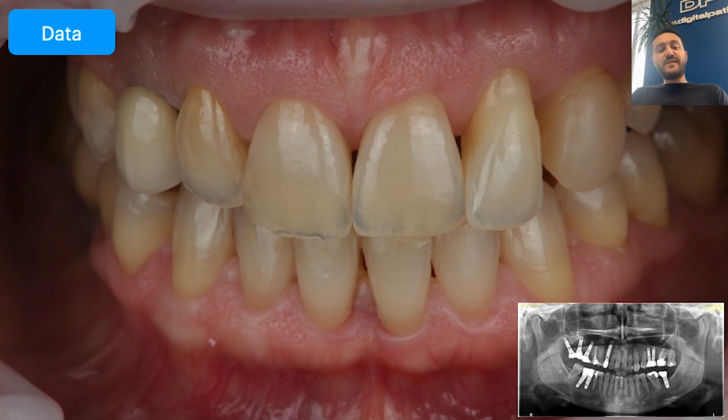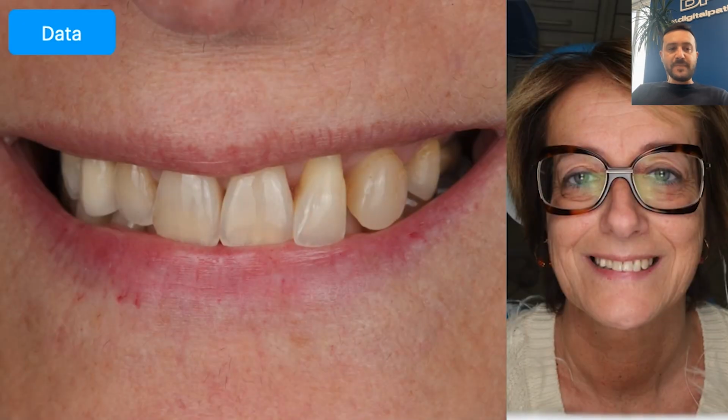Because dentistry isn't just about the teeth, it's about the person. To truly understand what kind of aesthetic and functional outcome we want to create, we need context, and the context is the face. So here we have the face of our patient. We can see a few key elements that immediately give more context: a gingival display that is not excessive, an elongated facial shape, and thin lips, all of which suggest a lean, elegant woman with refined taste, someone who appreciates subtle beauty over exaggerated change.